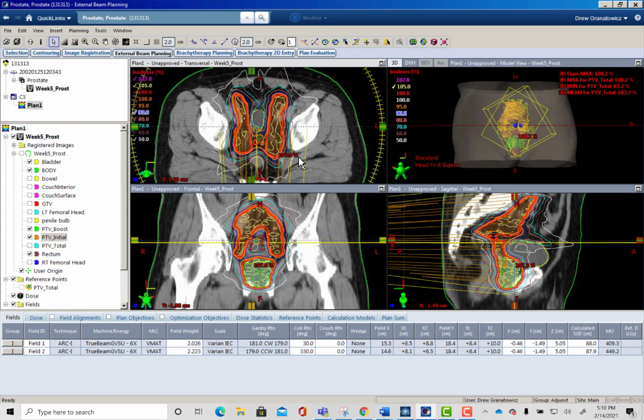Then next week, we'll learn how to evaluate the planned sum and what to do if we're not meeting one of those constraints. You may have to rerun this initial plan too. Okay, so this week and next week are very much kind of connected, okay? We're just breaking it down into 2 weeks.